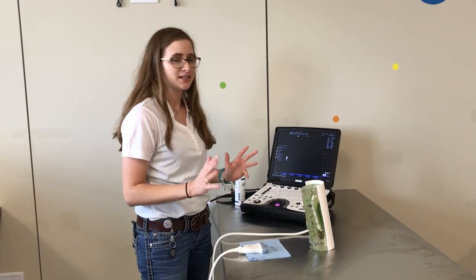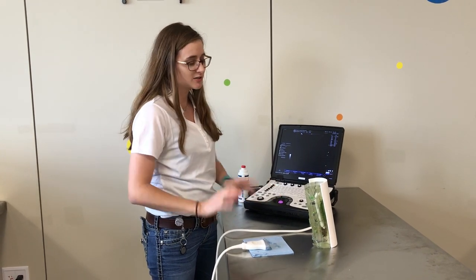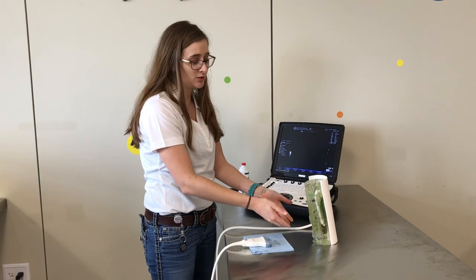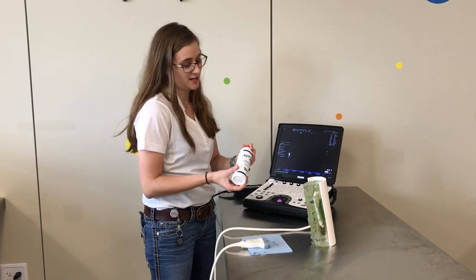Whenever you go to ultrasound the distal limb of a horse, make sure you start by prepping the limb. To do that, you want to shave the area that you are going to view with the ultrasound. Clean it up really well and apply your ultrasound gel.